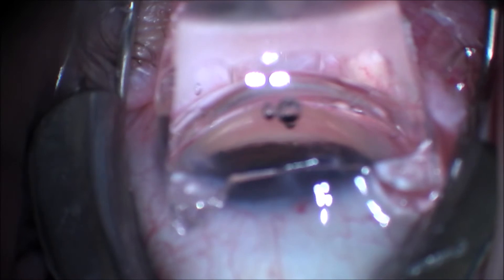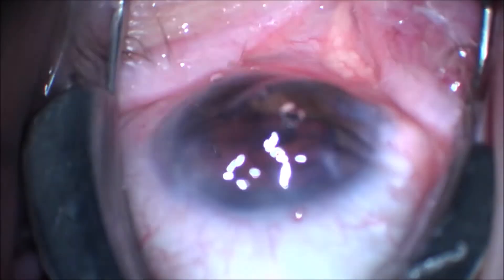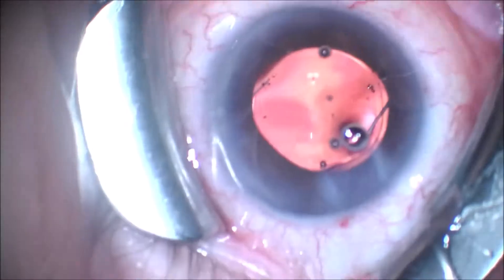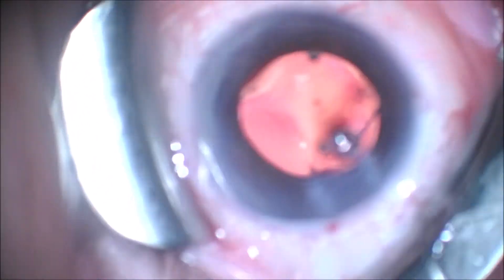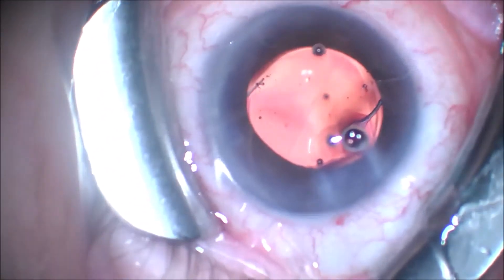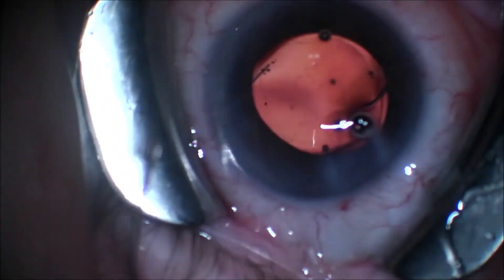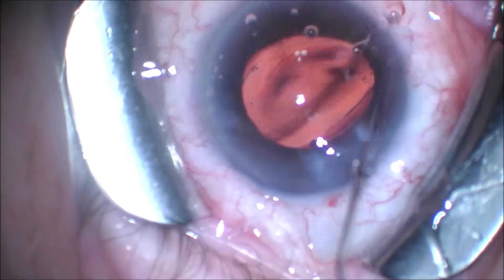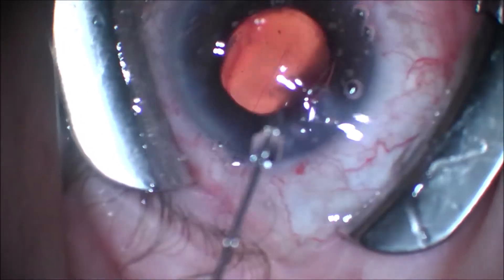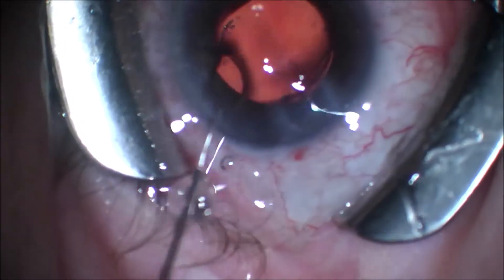Blood is often seen refluxing out of the iStent injects and out of the trephinated trabecular meshwork. This shows reflux of blood from Schlemm's canal and the aqueous veins.